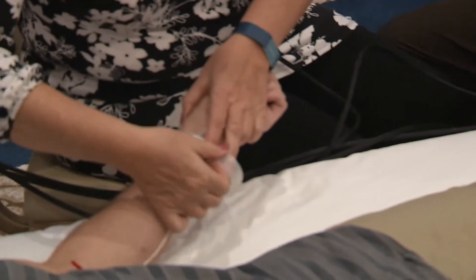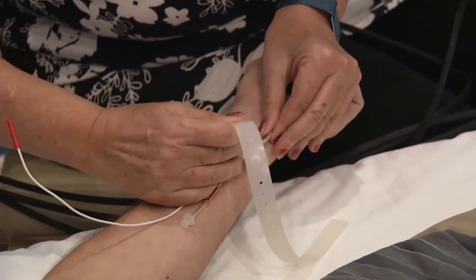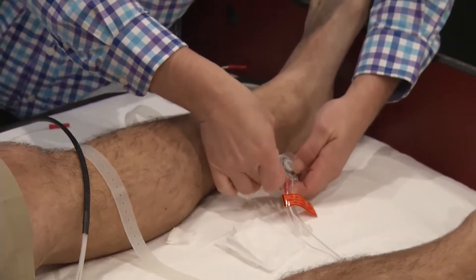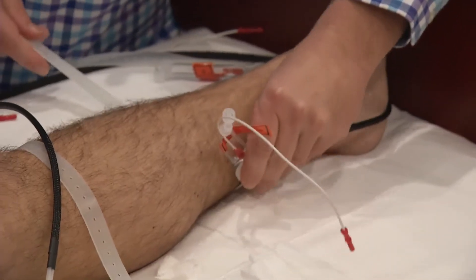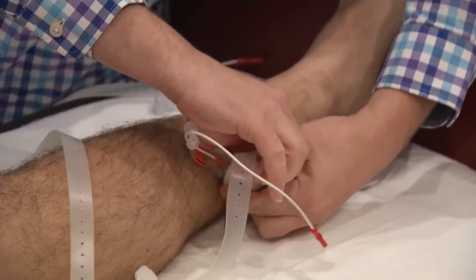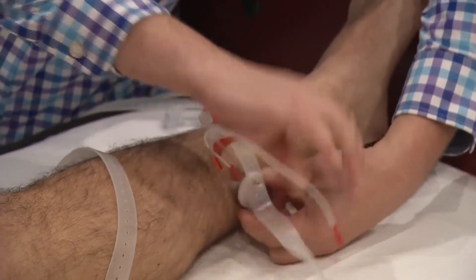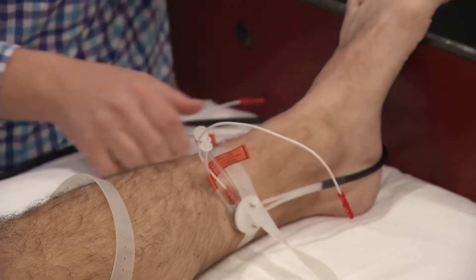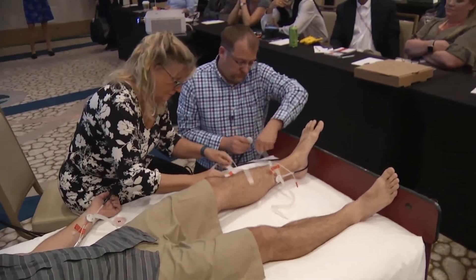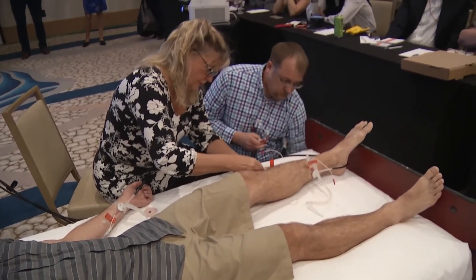After cleaning the site, the capsules are placed on with a moderate amount of pressure using those elastic wraps. You don't want excessive pressure that cuts off circulation, but you want it snug — because if it gets too loose there are leaks, and leaks are very annoying. It takes a while for the system to dry out and you have to wait, which delays things unnecessarily for patients.